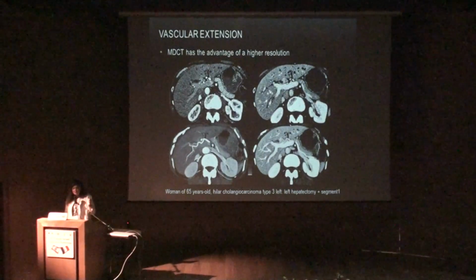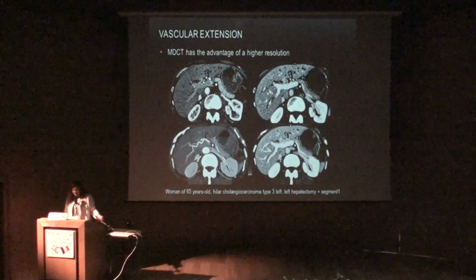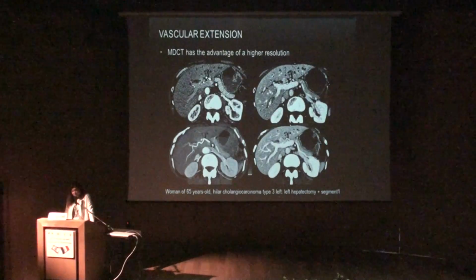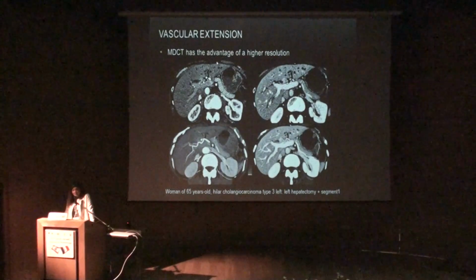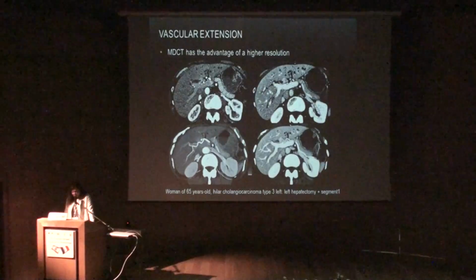So the second question was, is there vascular extension? That is very important too for surgery. To answer this question, probably CT has the advantage of higher resolution in comparison to MRI. I'll show you this example.